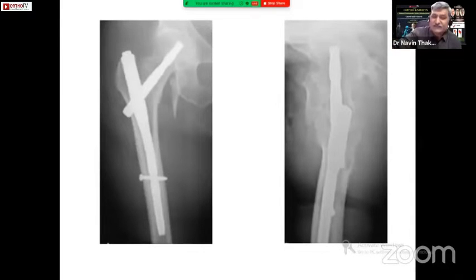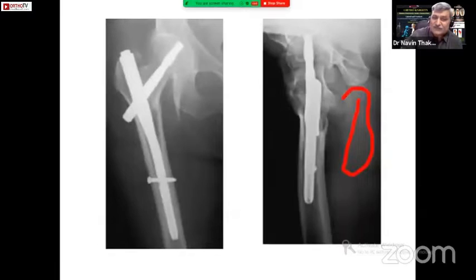Okay. This was the follow-up, right? As you see, there is nothing to support posterolaterally here. Again, same thing. It looks good in the follow-up, but as you see, it goes into varus, and that neutral reduction goes into negative reduction, and due to the varus, toggling has started, and now it has penetrated inside the joint.